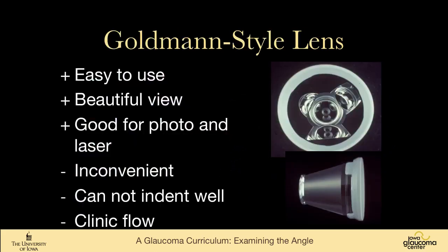So the Goldmann style lenses are easy to use, beautiful view. They're great for photography and laser. So if I'm doing a laser procedure in the angle, always use a Goldmann style lens, or many of them that are designed specifically for laser use. Or when I want to do videography for my website on gonioscopy, I would use a Goldmann style lens. But they're less convenient. They can't be used really to do indentation with any sort of power at all.